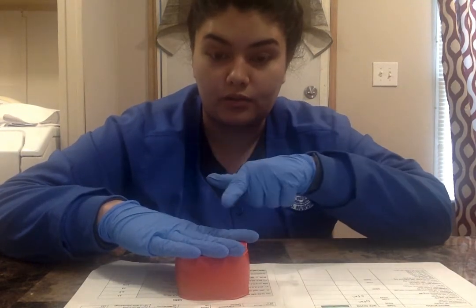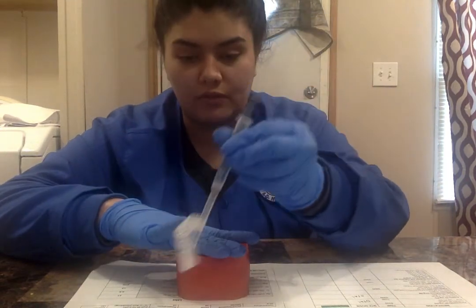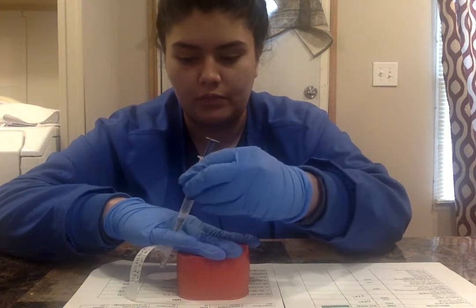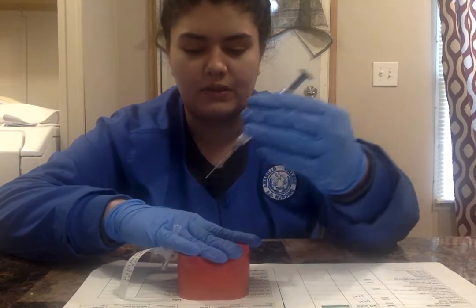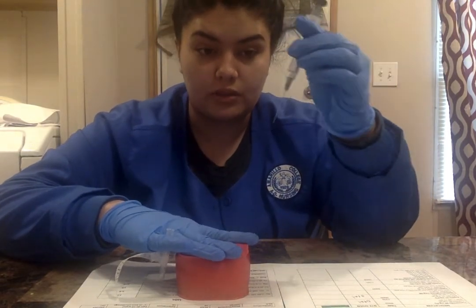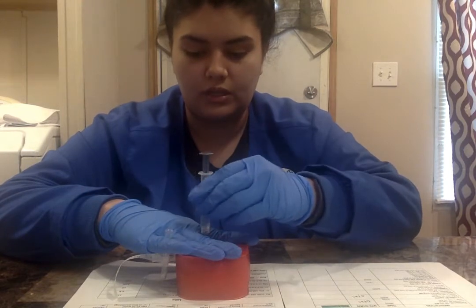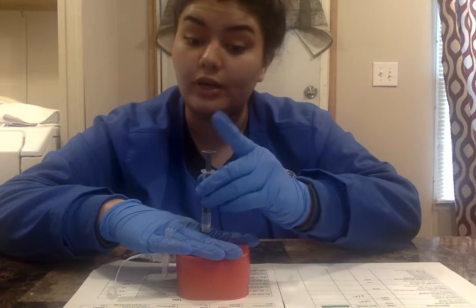I have my hand where it needs to be. I'm going to take the cap off of my medicine using my pinky. Oh, okay, we'll pretend that didn't happen. Okay, now I'm going to go in at a 90-degree angle, and I'm going to inject my medicine. Oh no, I'm going to aspirate.